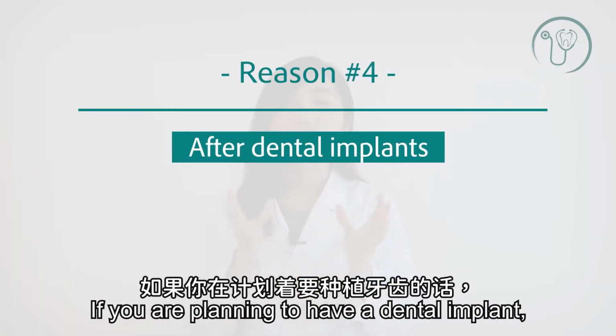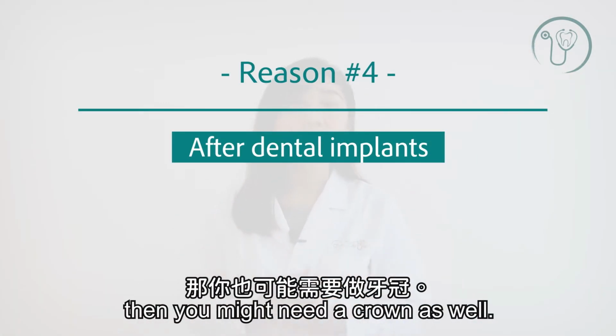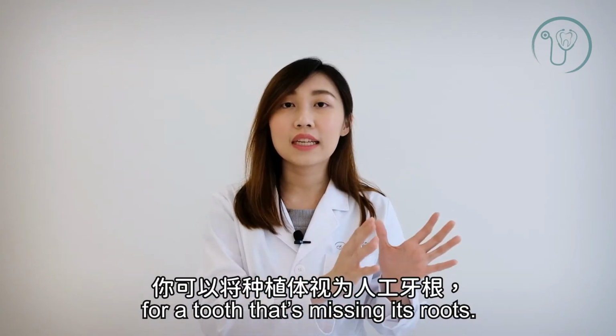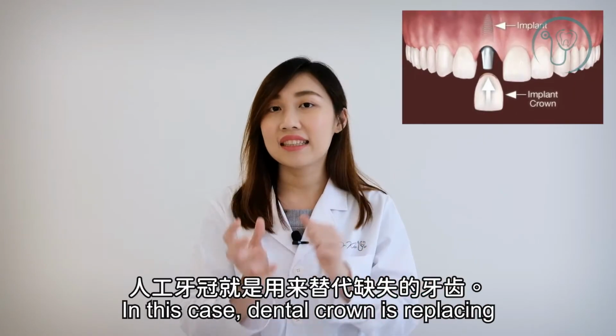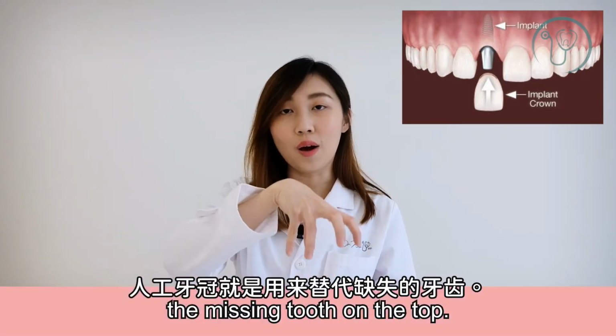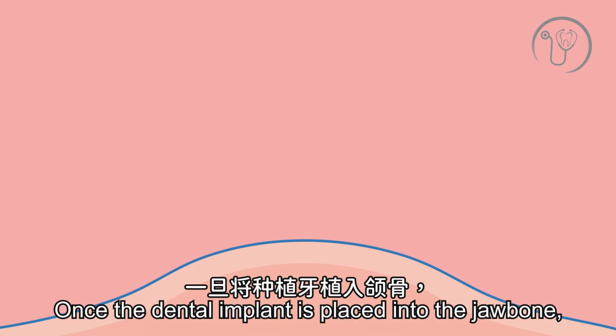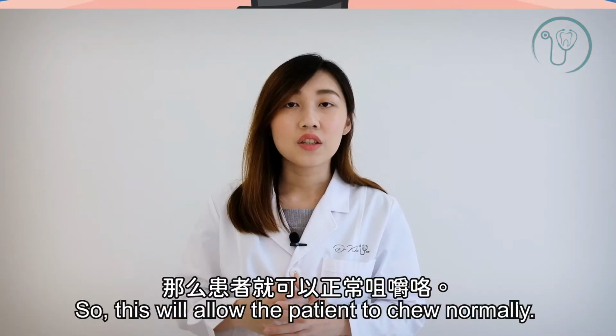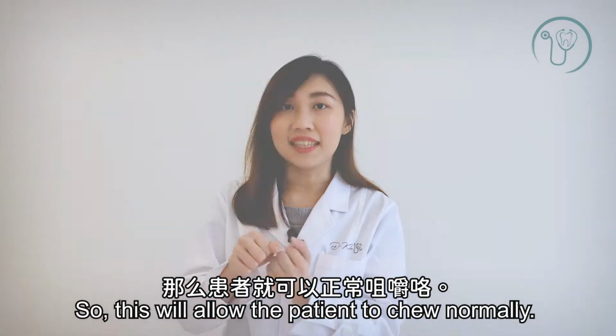If you are planning to have a dental implant, then you might need a crown as well. Think of the implant as a replacement for the tooth that is missing its roots. In this case, the dental crown is replacing the missing tooth on the top. Once the dental implant is placed into the jawbone, the crown will cover the top of the implant. This will allow the patient to chew normally.